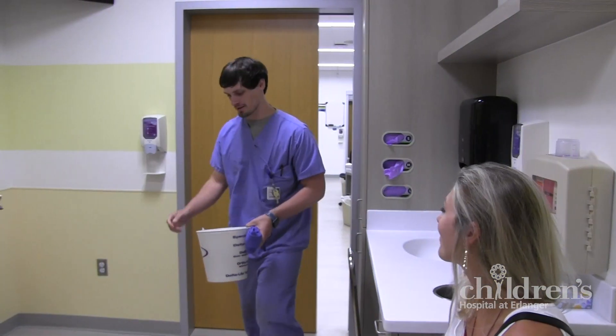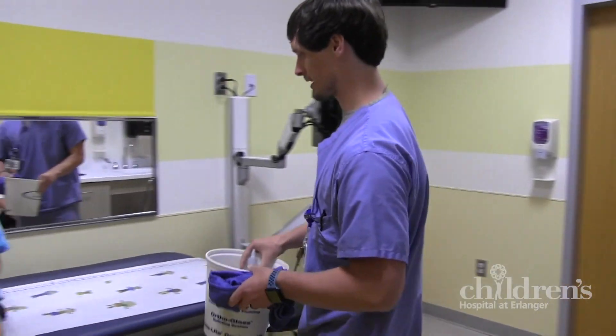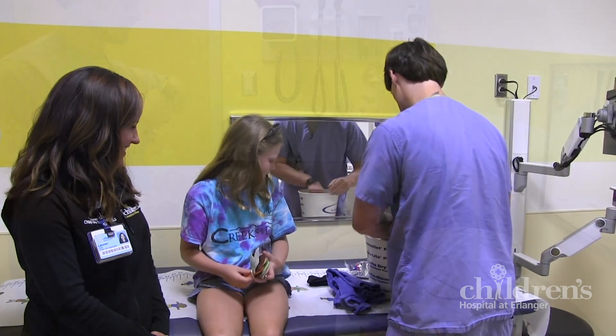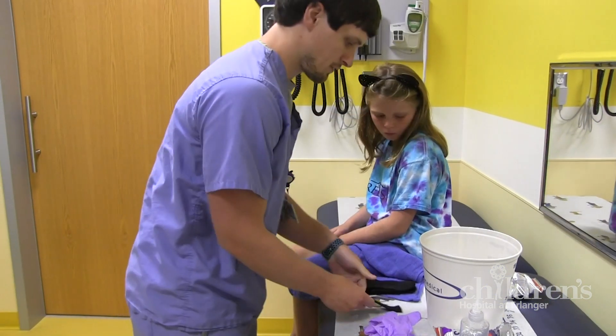You'll then meet one of our friendly casting technicians who will have a small bucket and other things to make your cast. They're really good at what they do and they'll have your cast done before you know it.